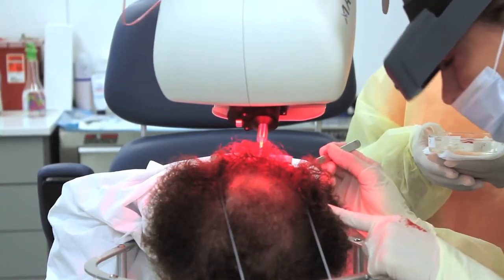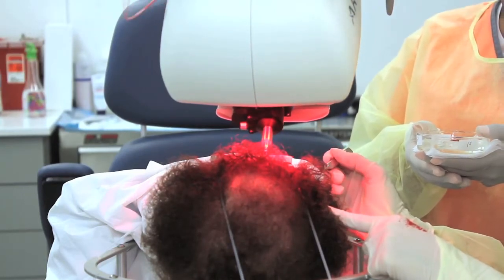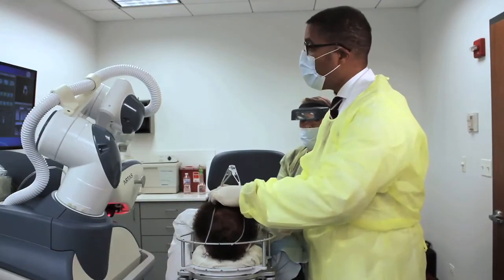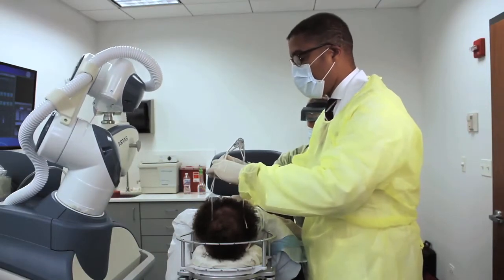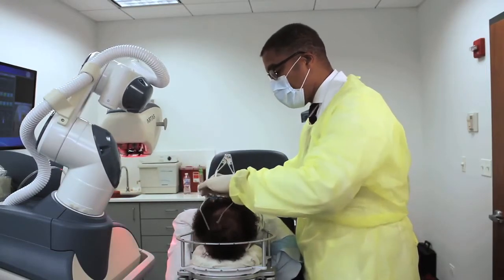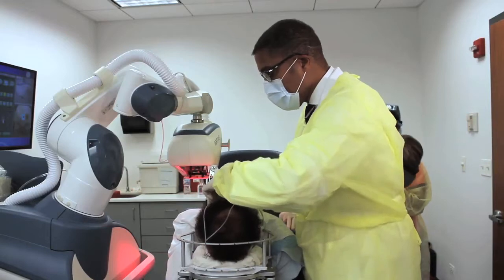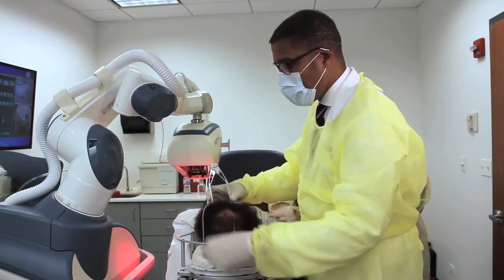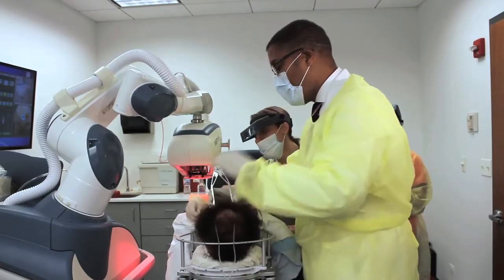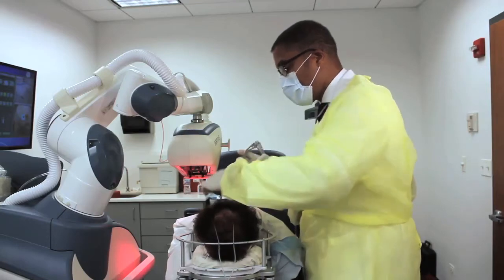We'll do 300 ones and 200 twos. So the first grid, we did a great job. We punched out 126 grafts, which is about right — we usually try to get 100 per grid. And we go right back into it again, put our grid down. You want this tight because you want the hair to stay still. Any movement causes transection, so you want this scalp and hair to remain still throughout the punching process.